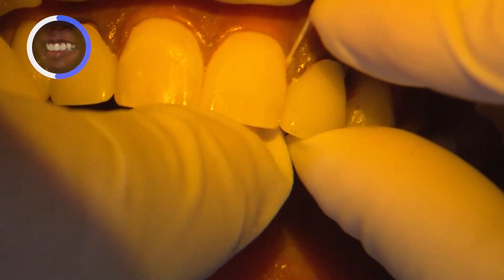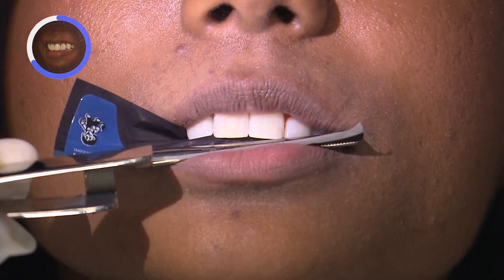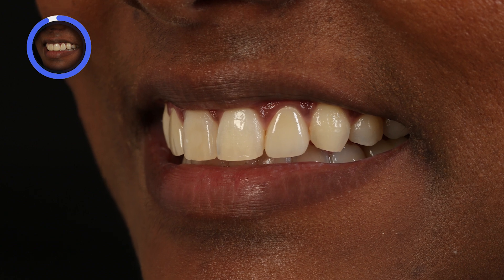After flossing to remove any excess interproximally, we final cure for 20 seconds per surface. That concludes the treatment process for this case. The patient was very happy with the new restorations, even commenting that the results exceeded her expectations.